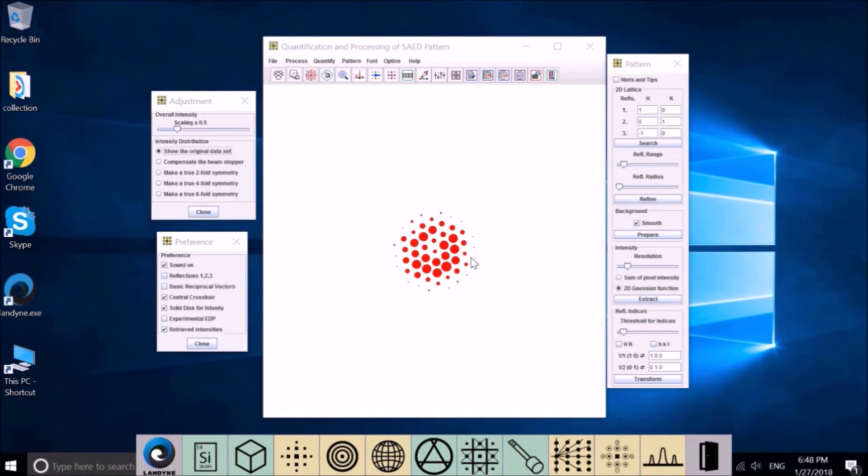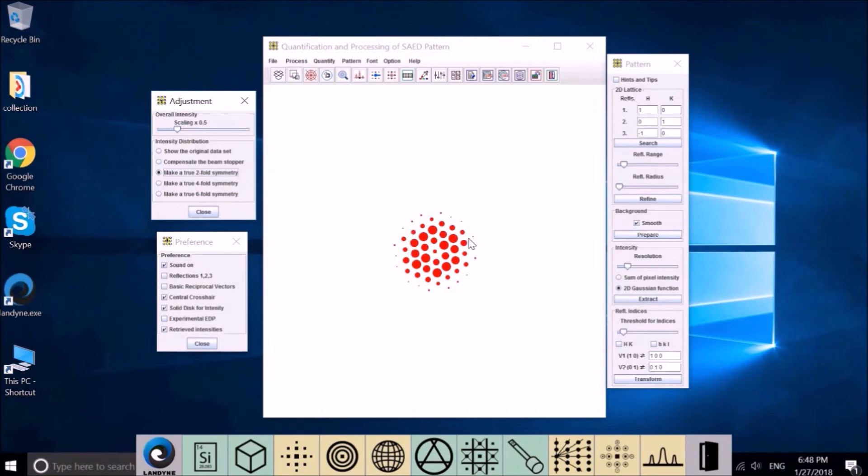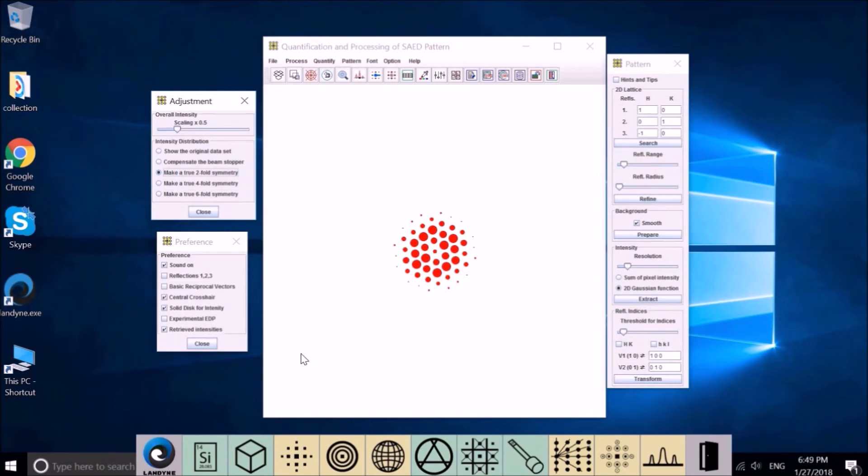This one is two-fold symmetry. This one is four-fold symmetry. And this one is six-fold symmetry. If we believe our pattern has a true two-fold symmetry, we should use this one. And see here, the diffraction pattern shows you modify, restore the true two-fold symmetry. This looks like a six-fold. If you believe it should be a six-fold symmetry, you may choose this one. It will change your pattern truly six-fold. But our pattern is actually two-fold, so we choose this one.